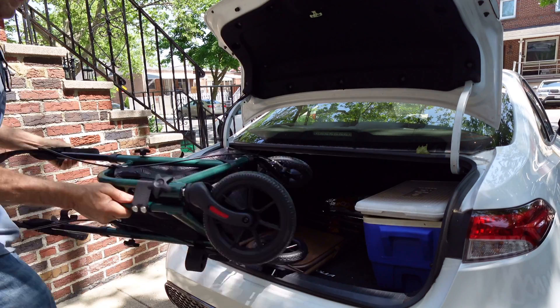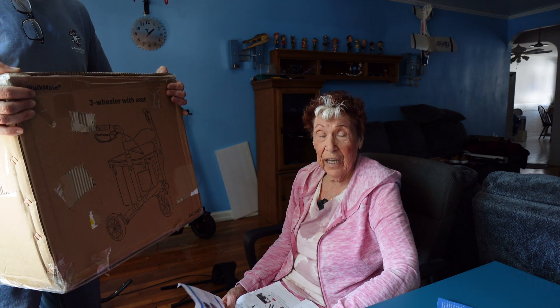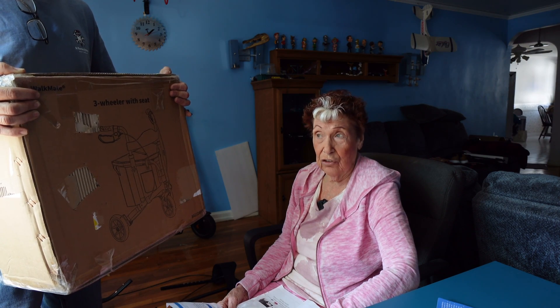We have a three-wheeler walker. It comes with a seat, holds up to 260 pounds, and it comes in a number of colors. It has an 8-inch wheel. It could be adjusted to different heights, and you could check online for the details. It comes with a package list and an instruction guide that has five steps to tell you how to put it together, and we've laid out all the parts and we're ready to assemble.